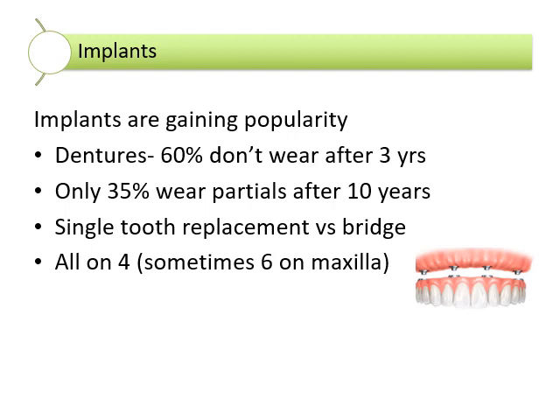So a lot of people are going to the use of implants to hold partials or to replace single teeth or to hold a denture in place. So in practice, you're going to come across implants. So today we're going to talk about different types of implants that are placed and how to take care of them and how to check to see if they're healthy or if they're in a disease state.